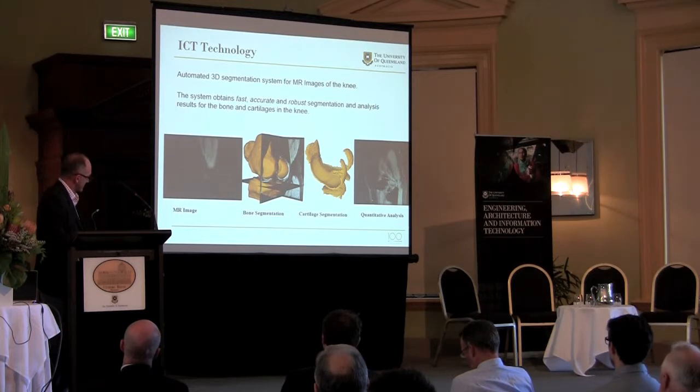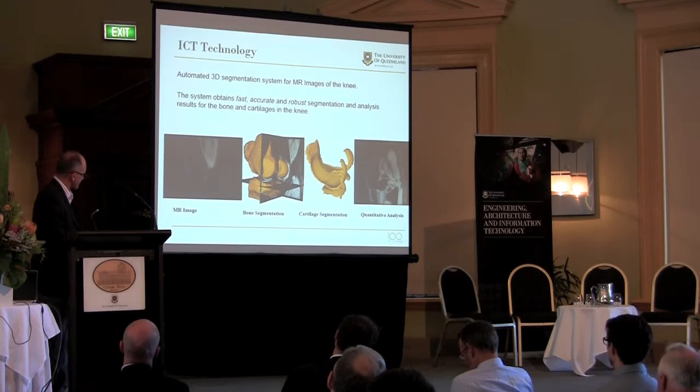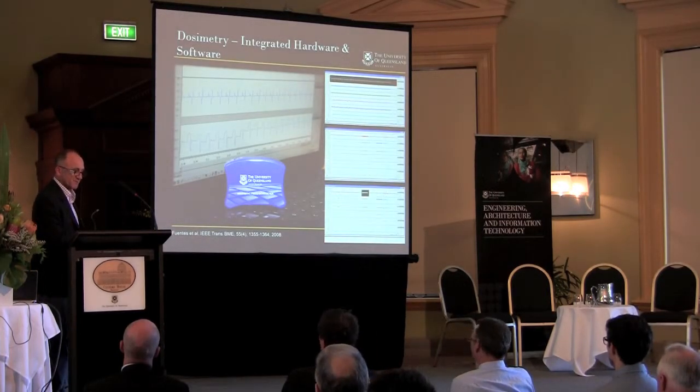And we now have a project with Siemens where we extract cartilage from these images in the dedicated imaging systems, provide a map, and then we also use some mathematics to test how normal that three-dimensional map is using statistical shape maps and spherical harmonic variations. So strange things happen through the course of a research project into commercialization.